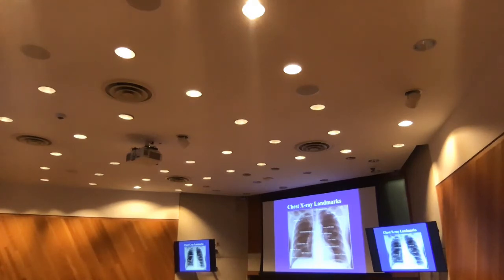Is it PA view or AP view? PA. PA, upright. You can say upright V, as in the word upright, so remember upright standing. Upright V. Upright V, right? All right.